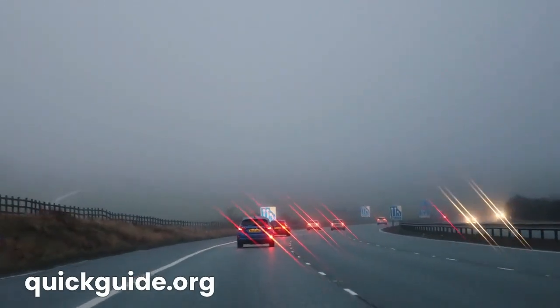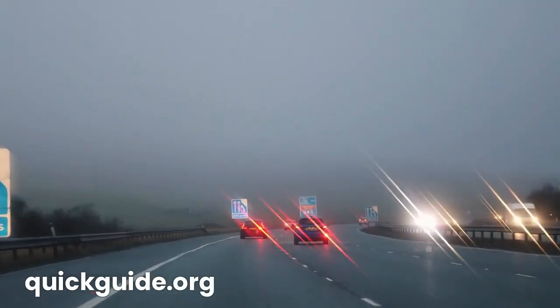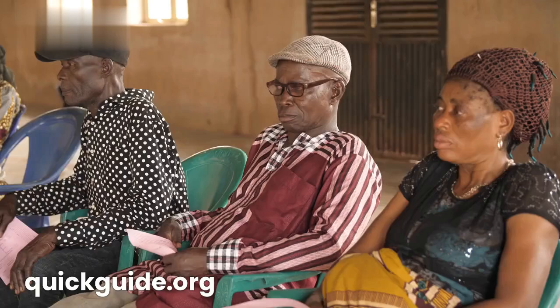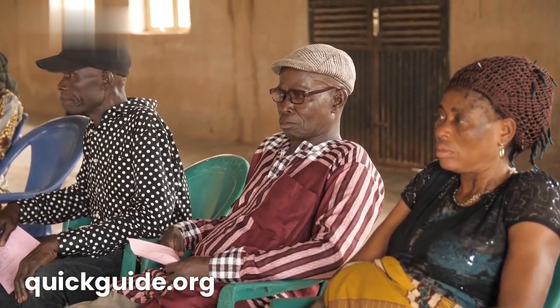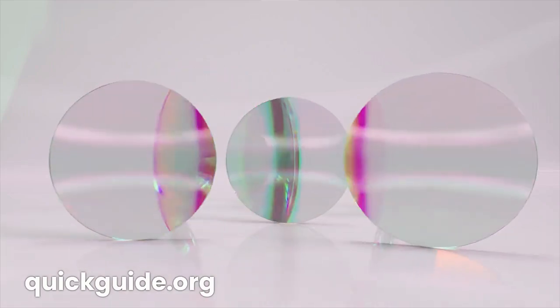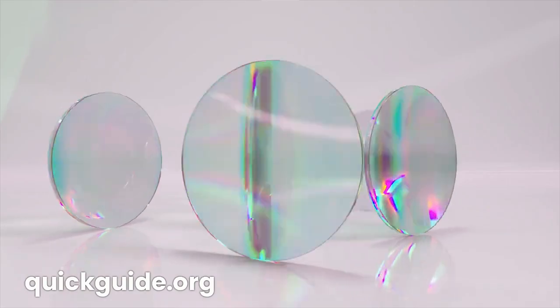The features that can be bucketed under optics should provide benefits of better image quality with less dysphotopsia. And lastly, the feature that comes under the delivery of lens should provide safe, uncomplicated lens implantation. In this video, we will discuss the material aspect of choosing the right IOL.